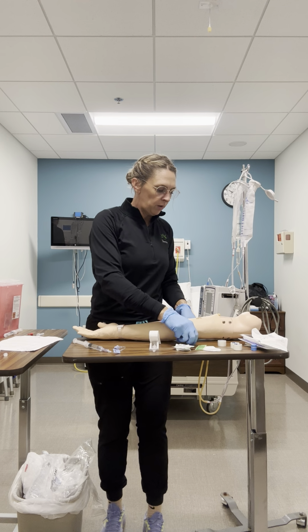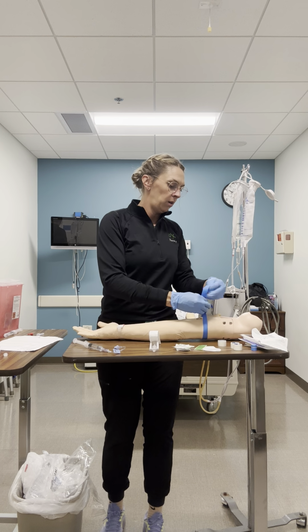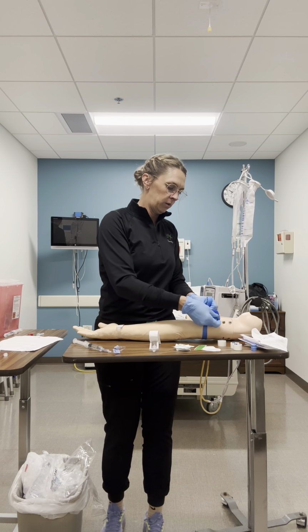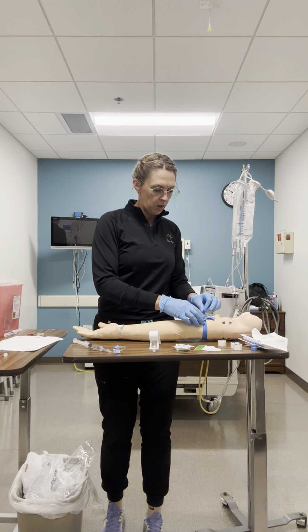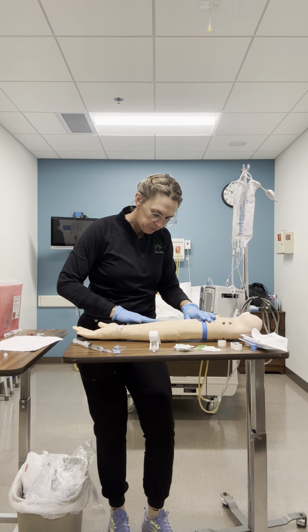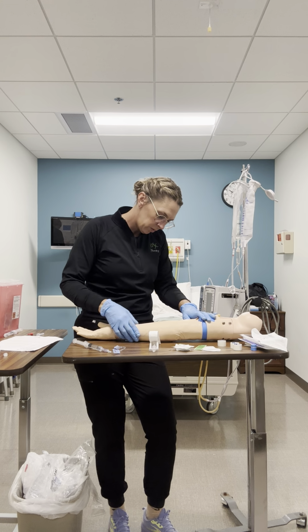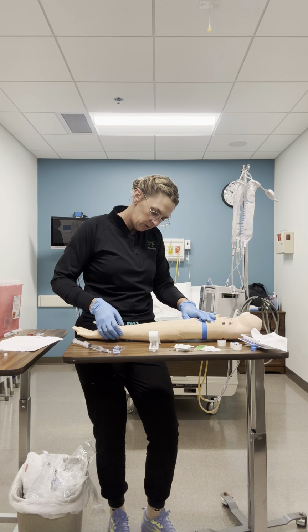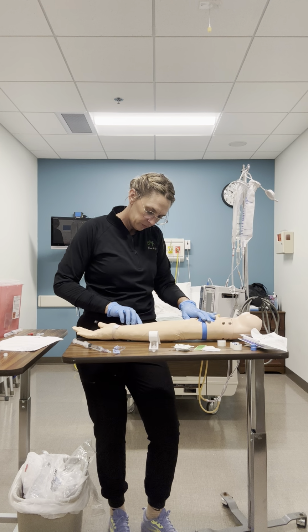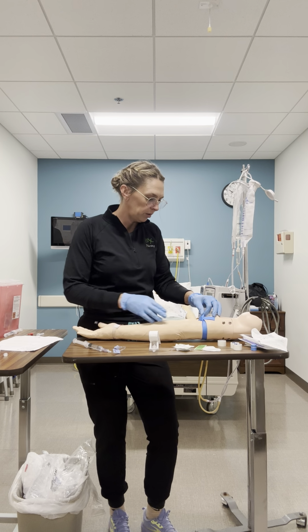Okay, so I am going to let the patient know that we're gonna put this tourniquet on. I'm gonna feel for a location as proximal or as distal as possible. So we're gonna go down here.